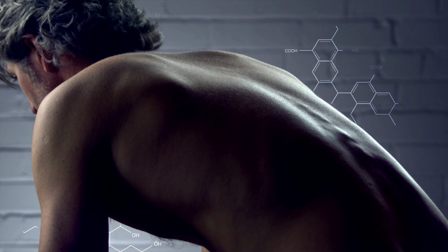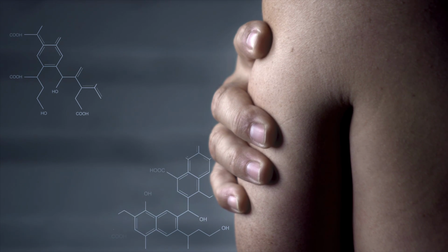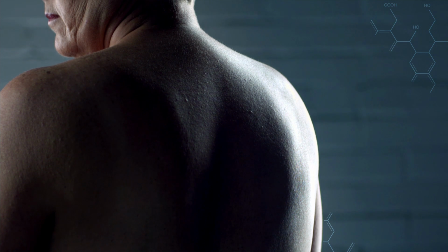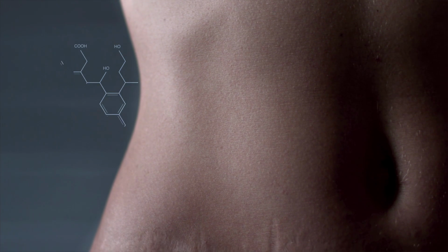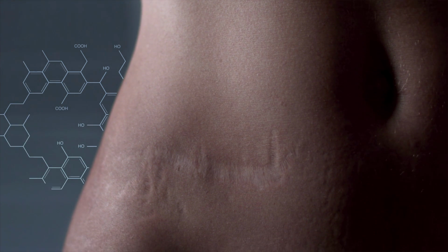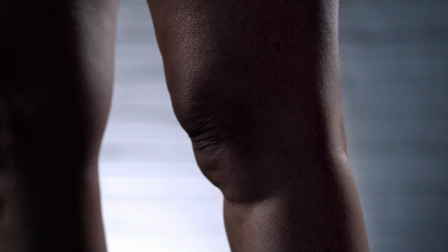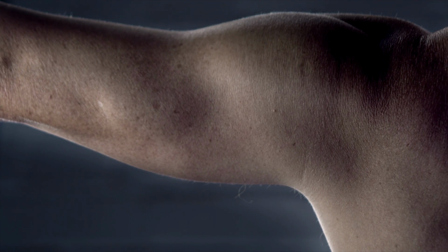The human body is an engineering wonder, but change is a constant in nature. As our bodies age, they change. The technologies to repair or replace parts of our bodies change too. Over time, orthopedic implants have evolved from bone to metal to polymer as scientists search for the strongest and most compatible solution.